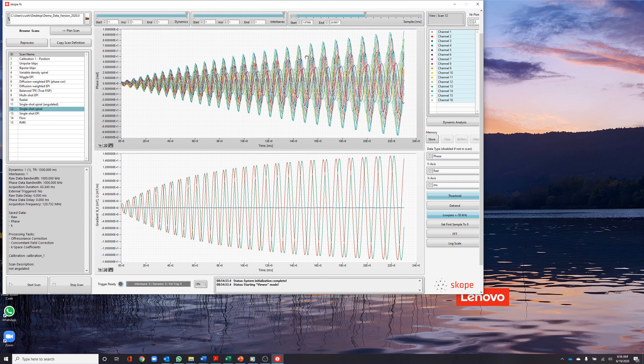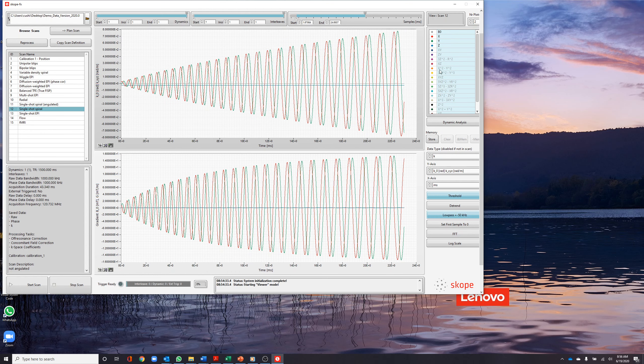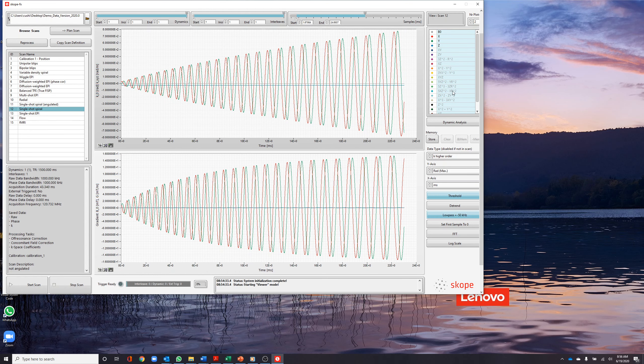K-space trajectories can be visualized in three ways in ScopeFX. Zero-th and first-order terms can be displayed, or the complete 16 higher-order encoding model, or as parametric data.